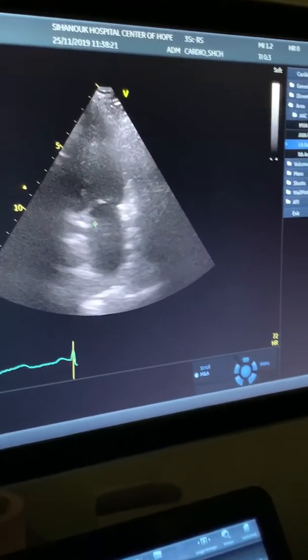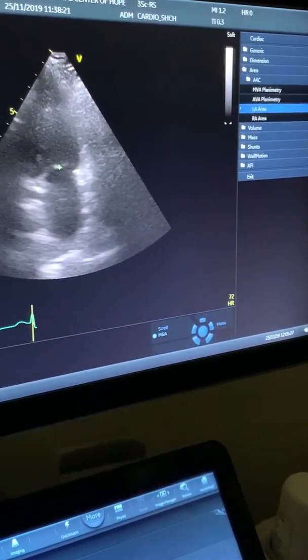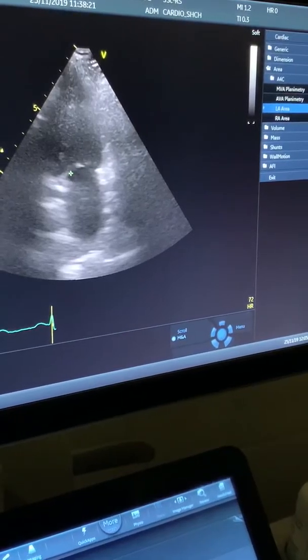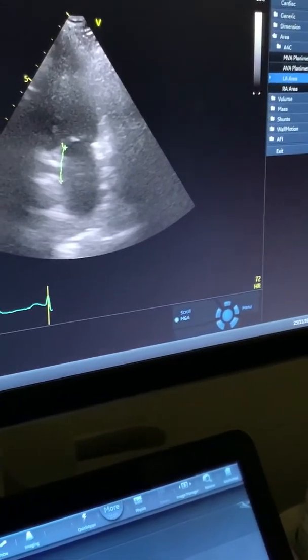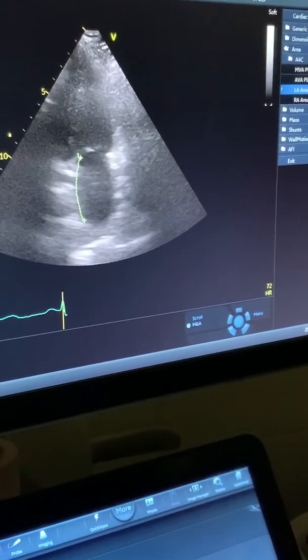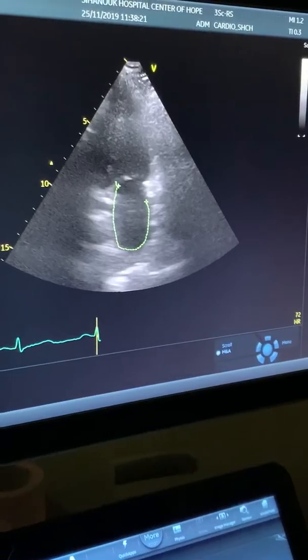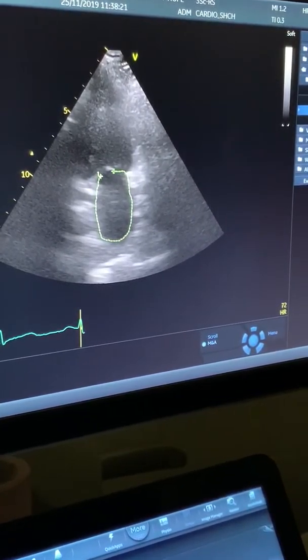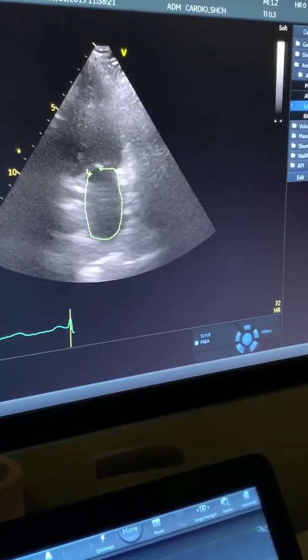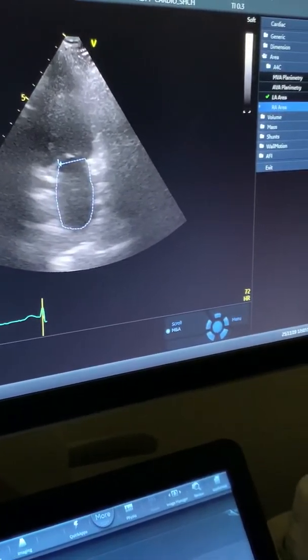In four chamber view, right? Because it's the easiest analysis. So this is the left atrium, right? Yes, this is the left atrium. I never go to the right yet. We only do the TR. So it's clear for you too? Okay. Later in the afternoon, I'll show you how to do the AFI.